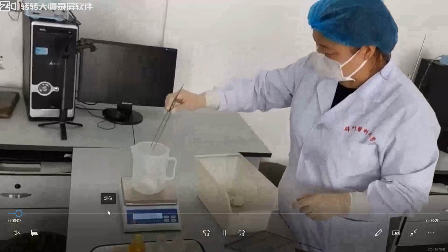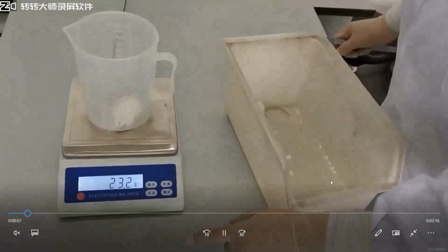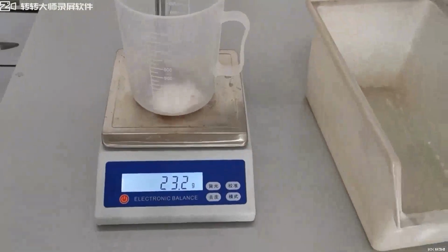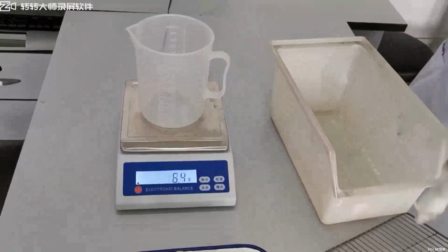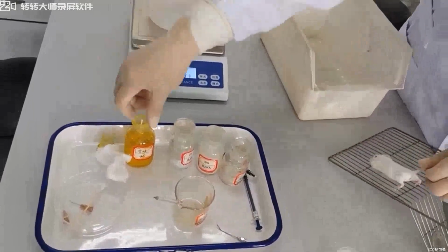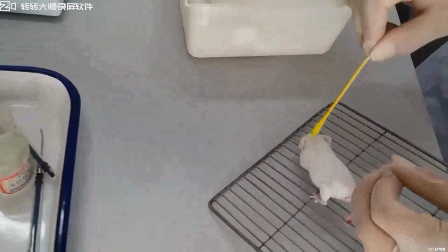Take 3 mice and weigh their body weight. It can be considered as 23 grams, according to rounding value. And then apply picric acid yellow solution at the different local area of the back of the mouse.